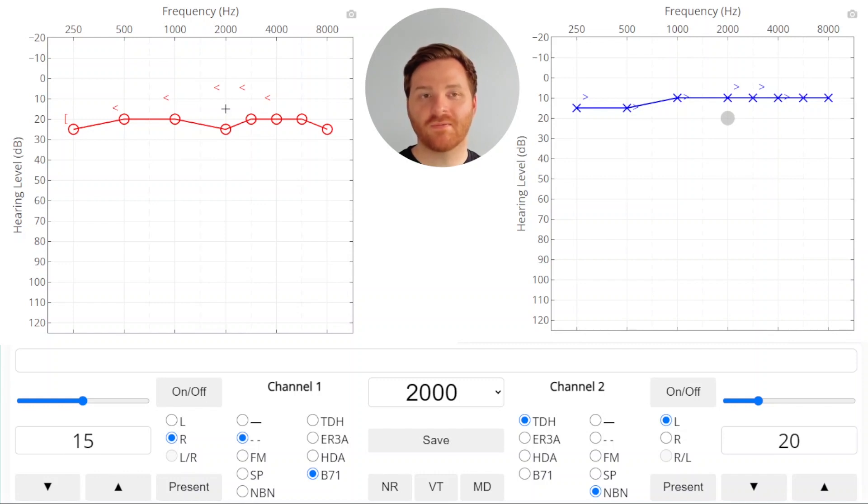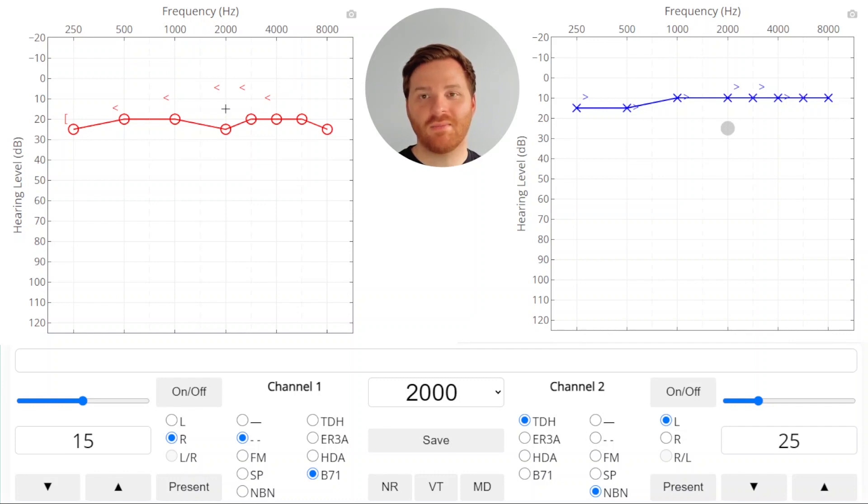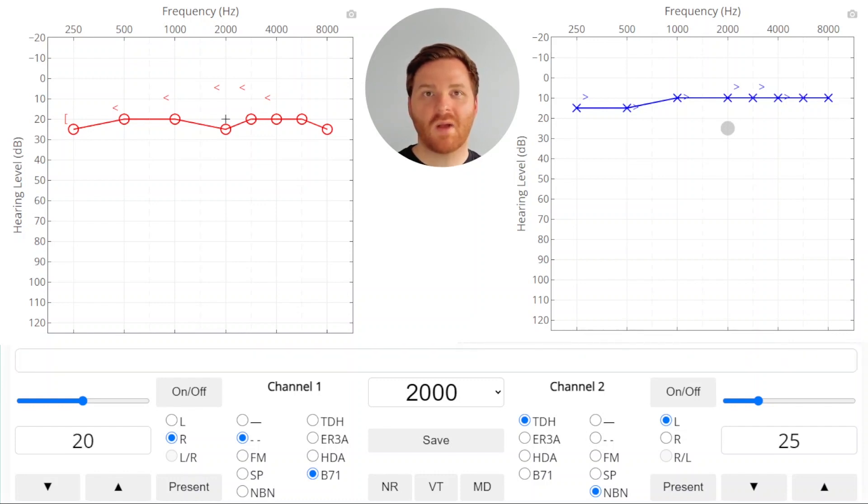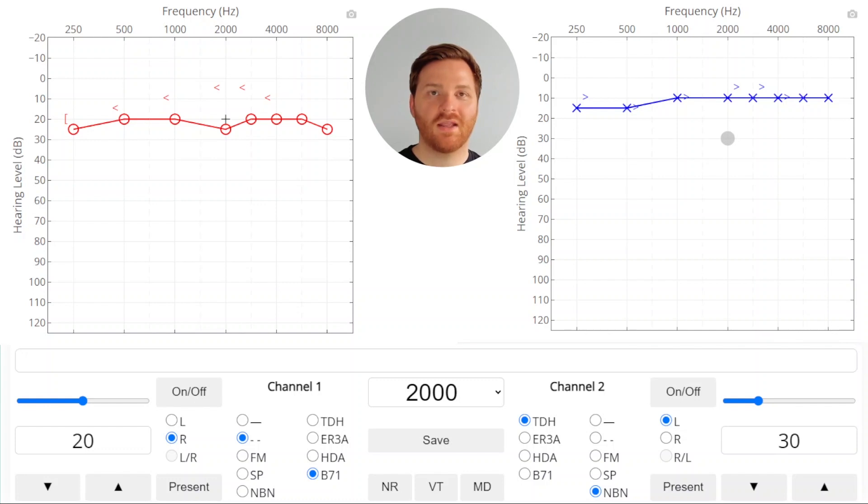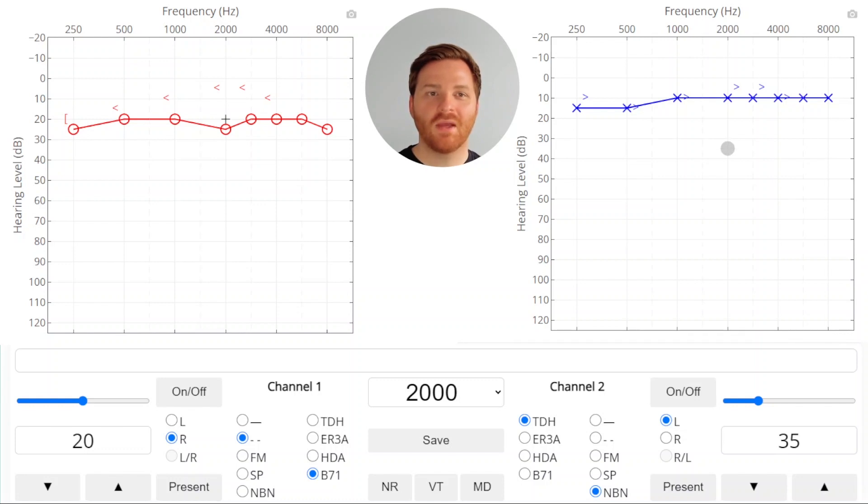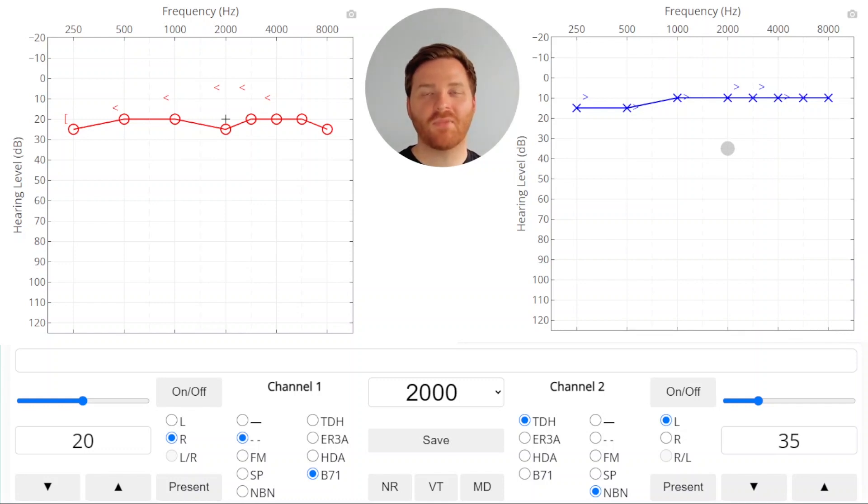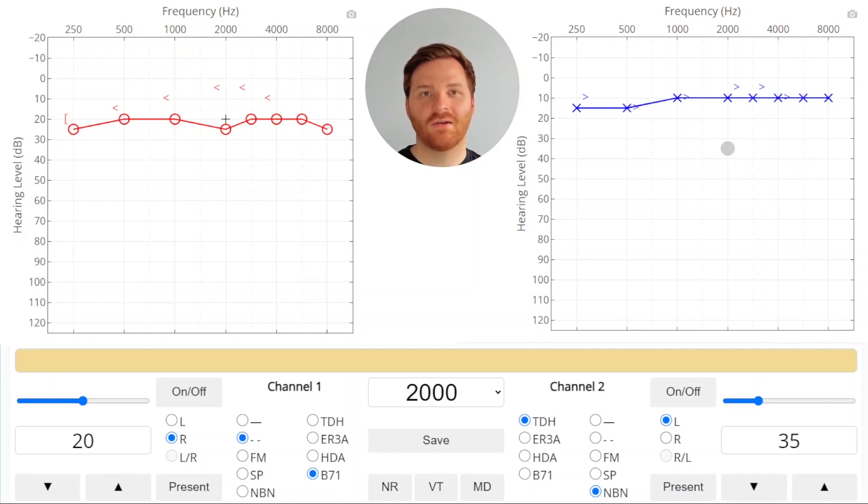So I'll raise the masker and present, and there's no response. So we're going to raise the stimulus, and we got a response. So we raise the masker to make sure that we're covering up any additional crossover. And this time we raised the masker and we still got a response. To make sure, we're going to raise it one more time. So now we're fairly confident that we're covering up the non-test ear with an air conduction masker. We present, we get another response, so we're going to save that as our true threshold.